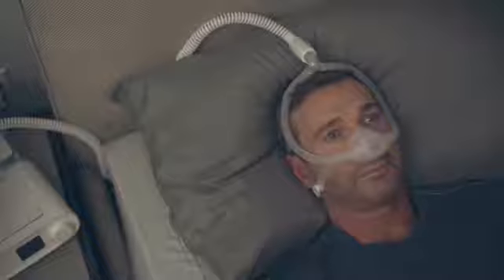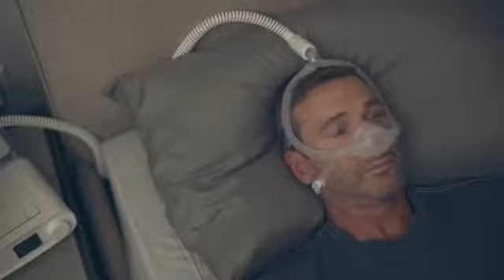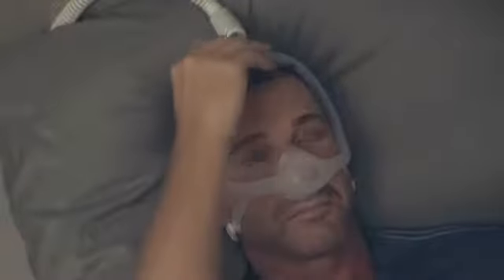Check the Philips DreamWisp Minimal Contact Nasal Mask for leaks while lying down and breathing normally through your nose. You should feel air escaping from the exhalation ports at the top and front of the mask. These must be left open to prevent rebreathing.